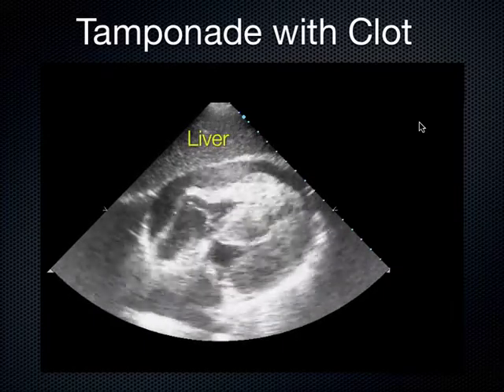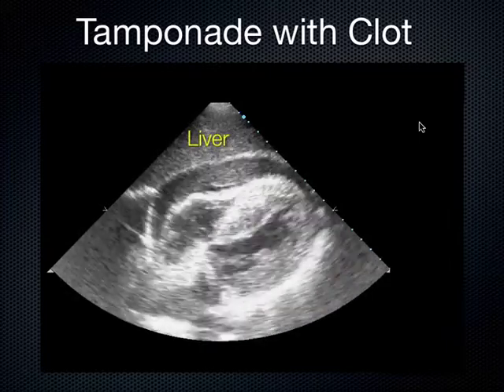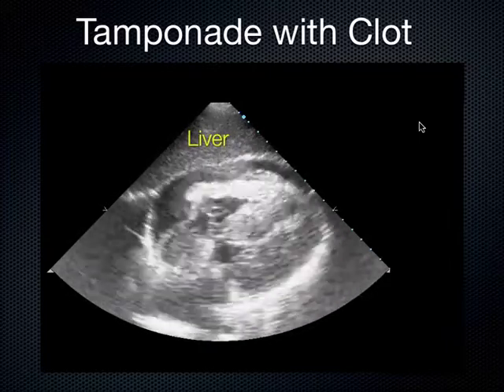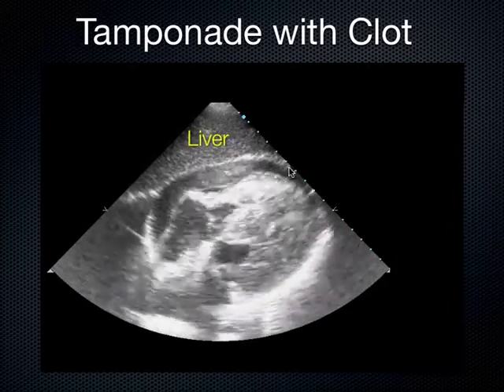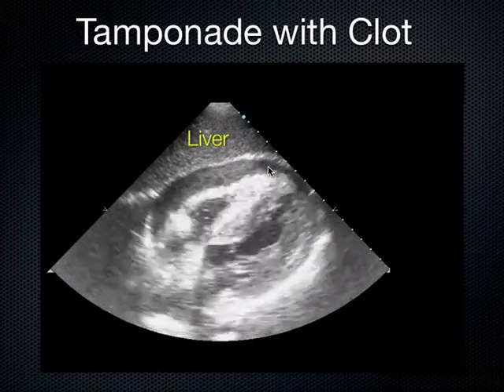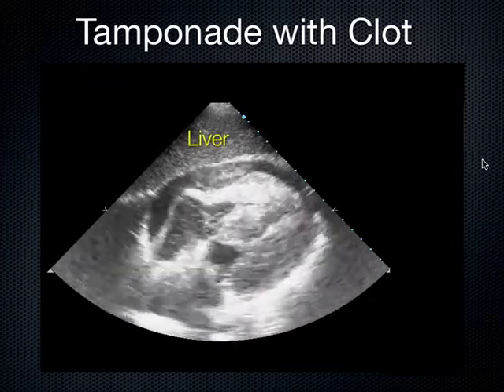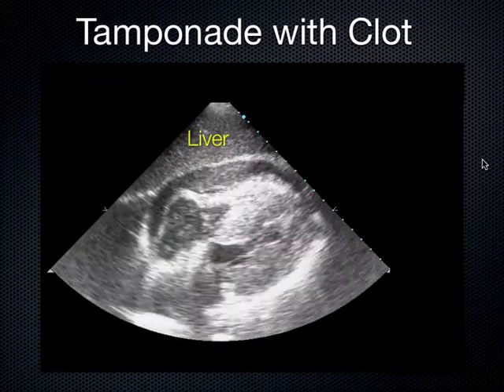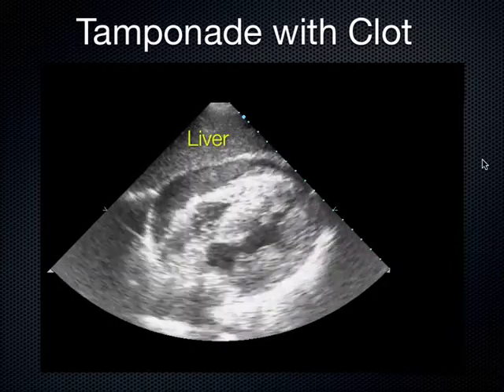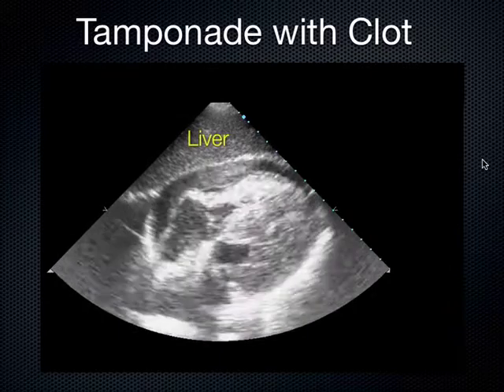There's another little thing I want to point out with this heart that I didn't notice the first time I looked at it, but the more I stare at this clip, the more apparent it becomes. It's normal to have this, but it's a little epicardial fat pad right here. See how that epicardial fat pad is outlined by the fluid and moves with the heart? That's another finding I'd point out, something I expect to see around a heart. I expect to see fat pads. Luckily, fat pads are less than 1 centimeter in thickness almost always.